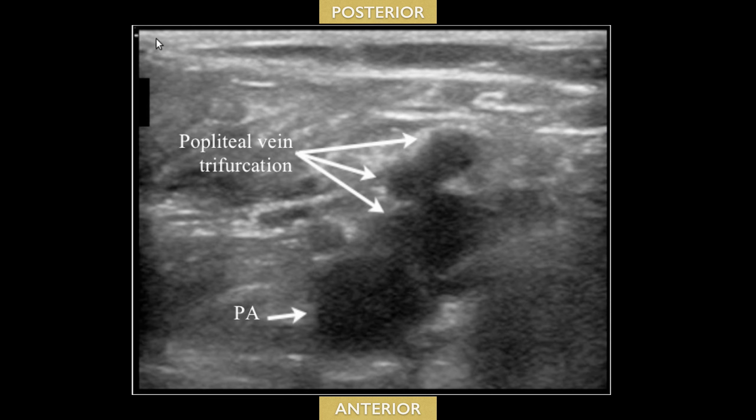You can scan a little more distally to where the popliteal vein trifurcates. This is optional, but during a formal scan they do image all the way to the popliteal vein trifurcation. If you can see the popliteal vein and it's compressible, that should be adequate for your purposes.